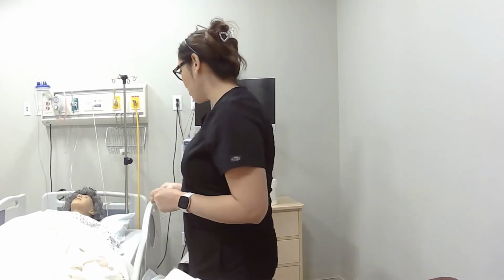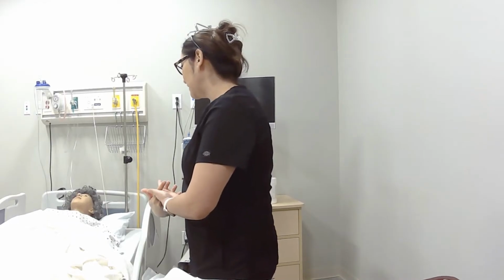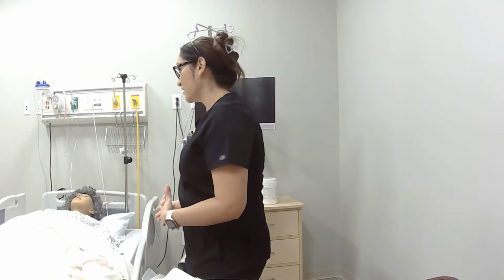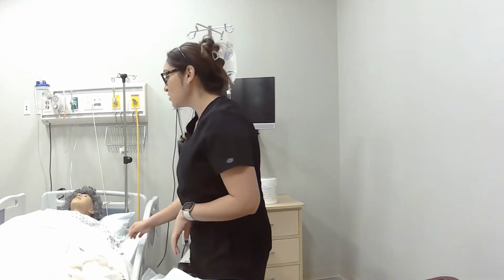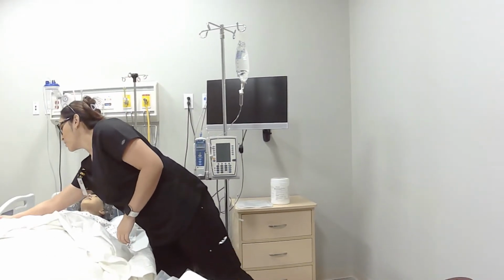You're going to feel some pressure, but you'll feel some relief once that Foley is in, once the catheter is in your bladder, because then that urinary retention will be relieved, okay? So before we start, we have to verify that we have the correct patient. So to do that, we are going to come and look for her ID.